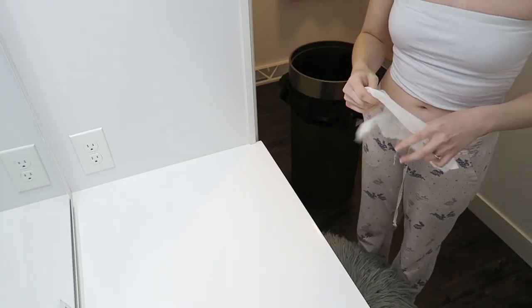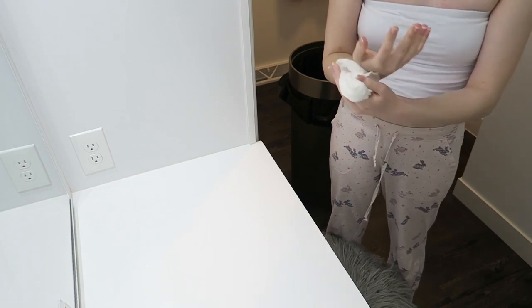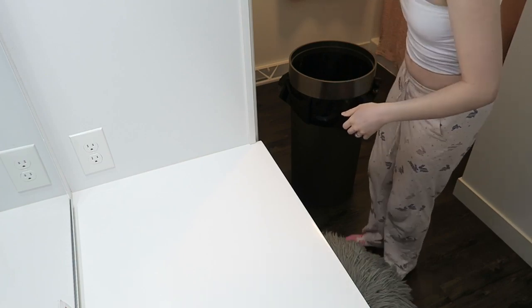Okay, so I'm ready to access, so I just washed my hands really well and dried them off with paper towel because paper towel tends to be cleaner than a reusable towel. So I'm gonna just go ahead and throw that in the garbage.